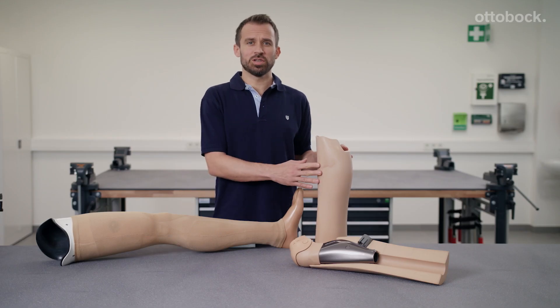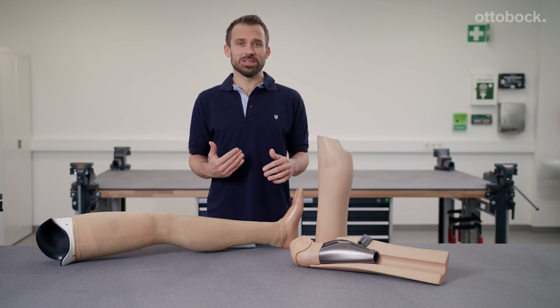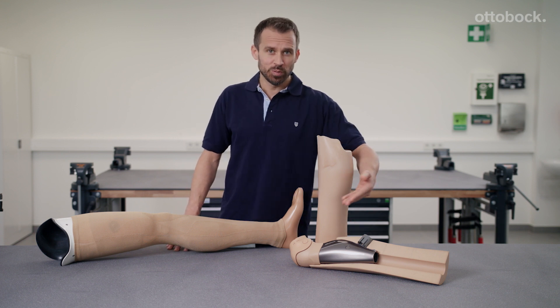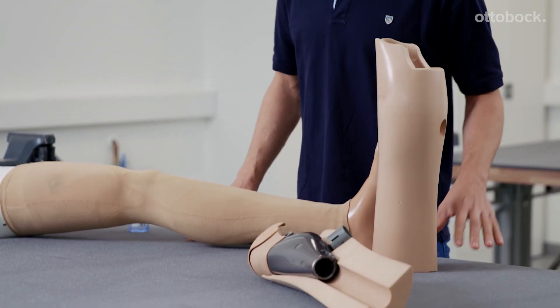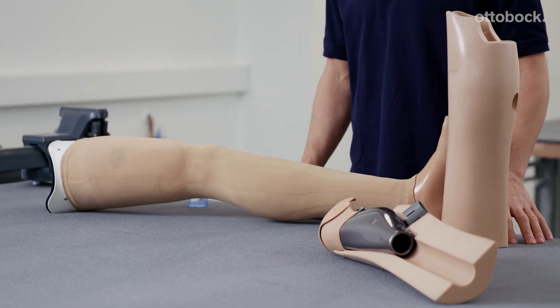The shank can be shaped according to the user's individual needs. An advantage for me as a technician is the fact that the inside of the functional shank is perfectly designed for the joint contour, which makes it easy to put on and remove the shank.